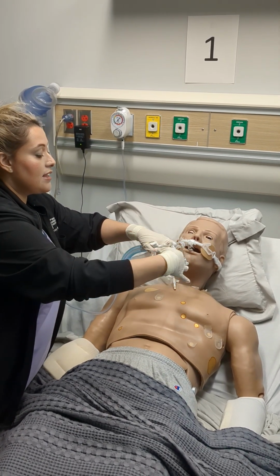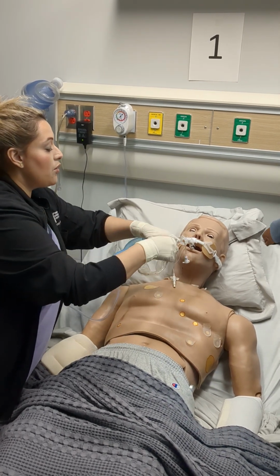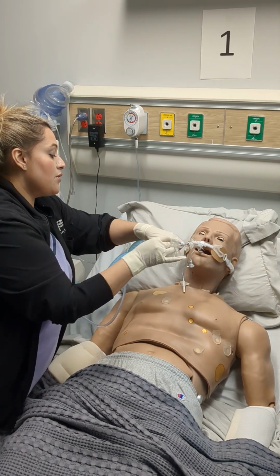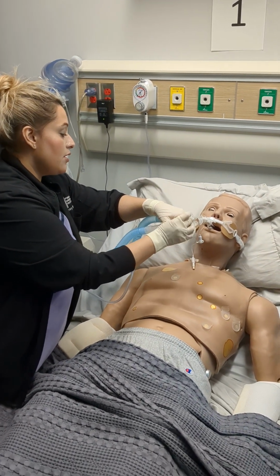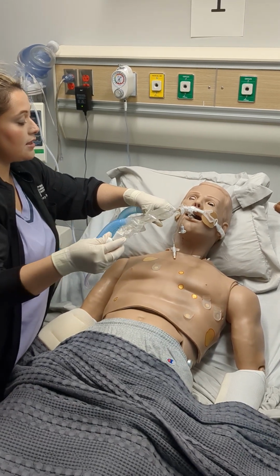To stabilize the tubing, so I don't pull on it or push it or do anything like that. I'm going to advance my suction catheter till I meet resistance, pull back 1 centimeter, and then apply suction.